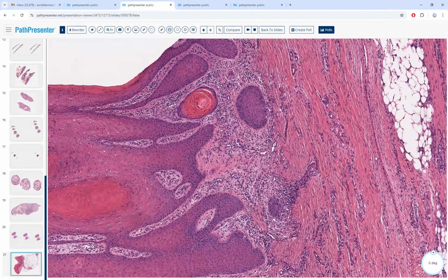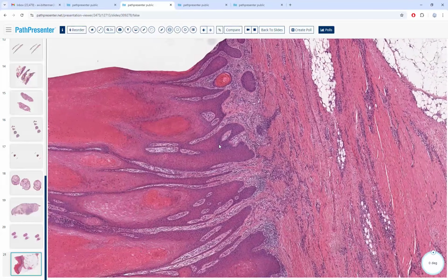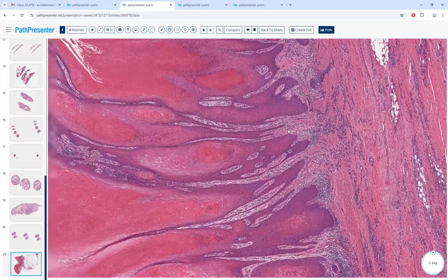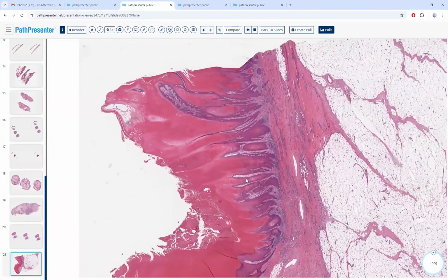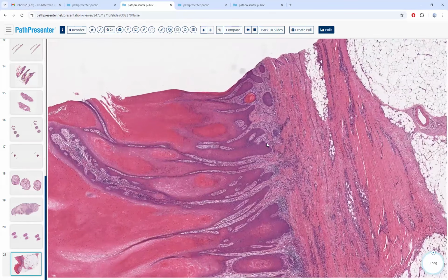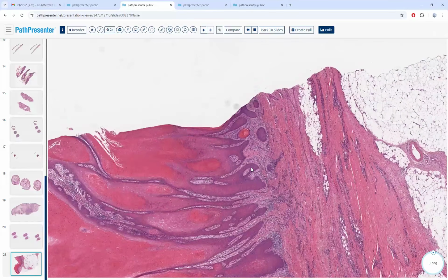Can I ask a question? Yeah. So it's true that with a regular wart, you can draw a line. It grows upward, not downward, even though it looks like it's growing downward. If you could draw a line, you see that it's all starting from the same place, right? It grows upward. So you mentioned that these are pushing down into the dermis. Is that different? Are they actually growing down?